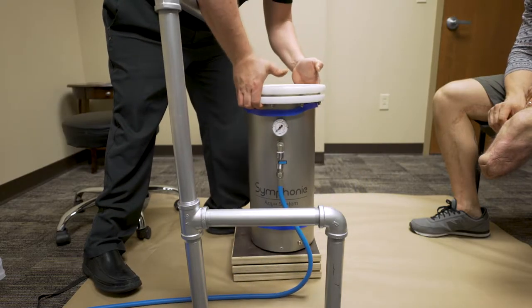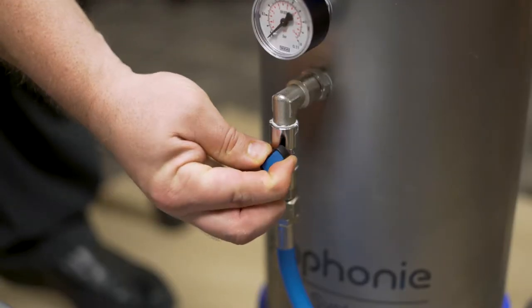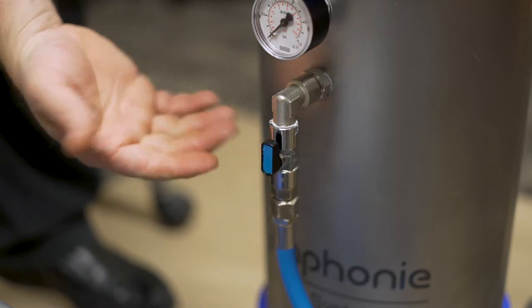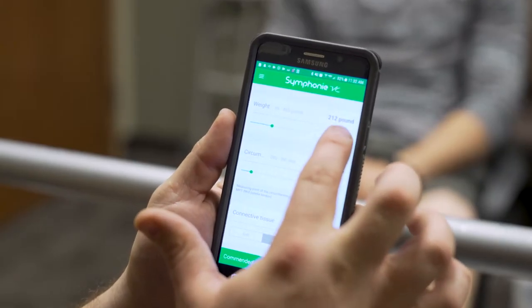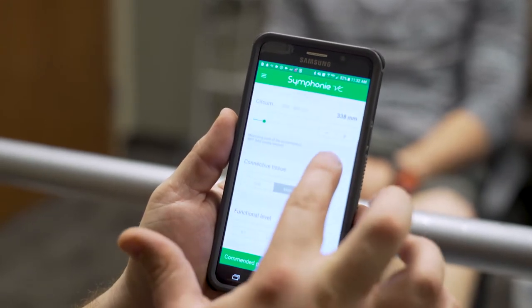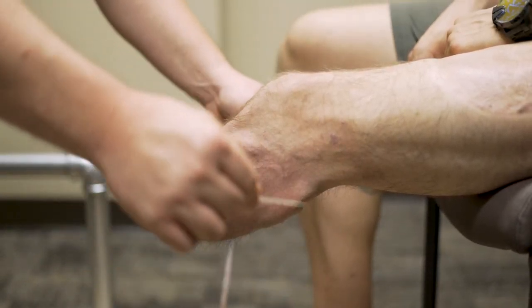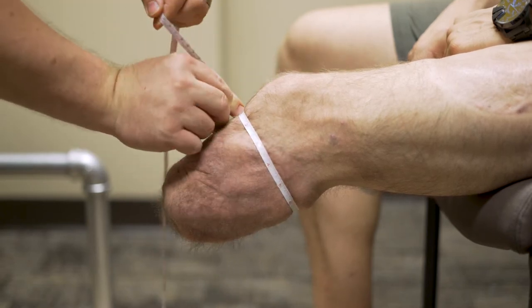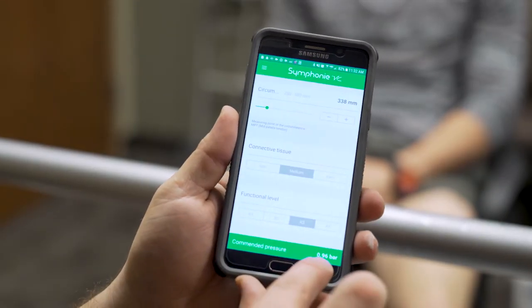Ensure that the tank is approximately half full. If it is not, remove water by opening the valve and letting water flow into the bag. To determine the correct pressure for the specific patient, use the Symphony VC app, available on Android and iPhone. You will need the patient's weight, circumference at mid-patellar tendon level, firmness of the tissue (firm, medium, or soft), and the patient's K level. When all these are entered, the app will give you the desired pressure.